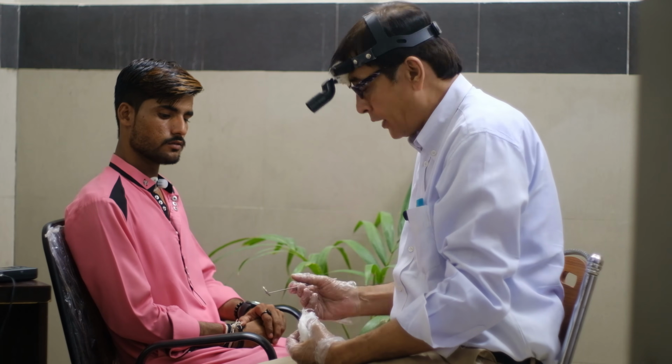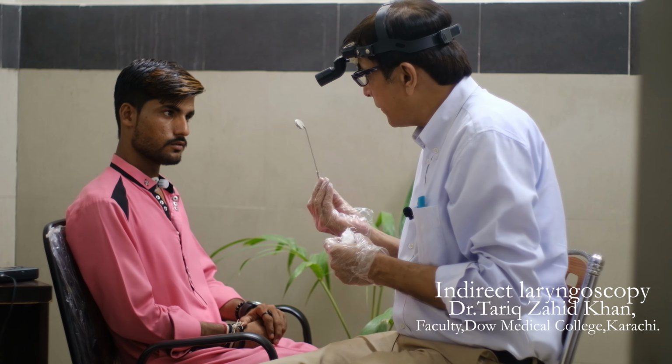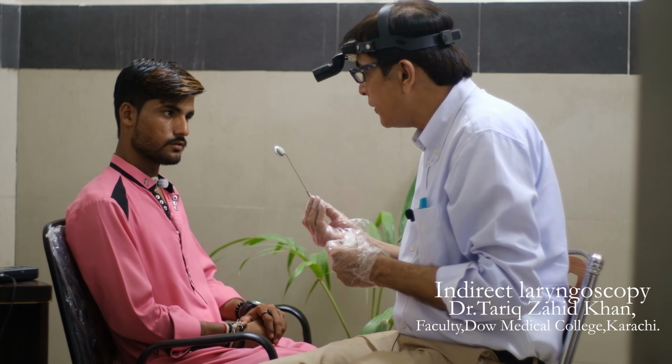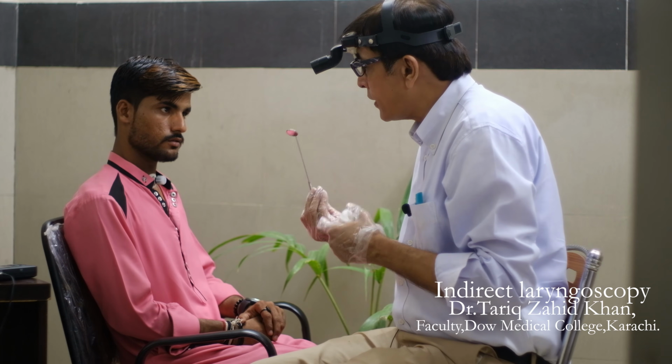First of all, we will discuss the position of the patient during this procedure. The patient would be seated on the side of the examiner, and the level of the patient would be slightly lower than the examiner. That means the examiner would be a little bit higher than the patient. The patient would be slightly leaned forward, and this position is known as the sniffing position, as if the patient is sniffing a flower. The chin of the patient would be directed towards the examiner.